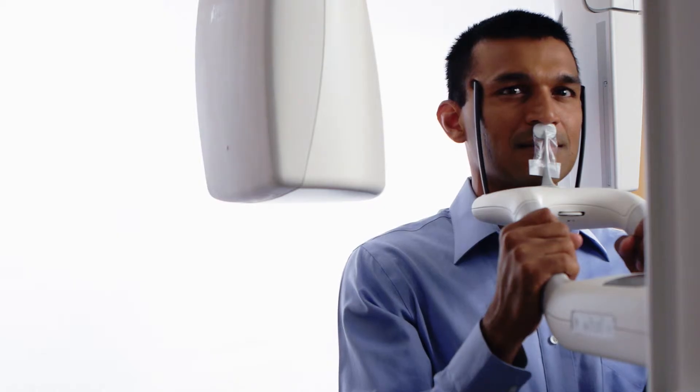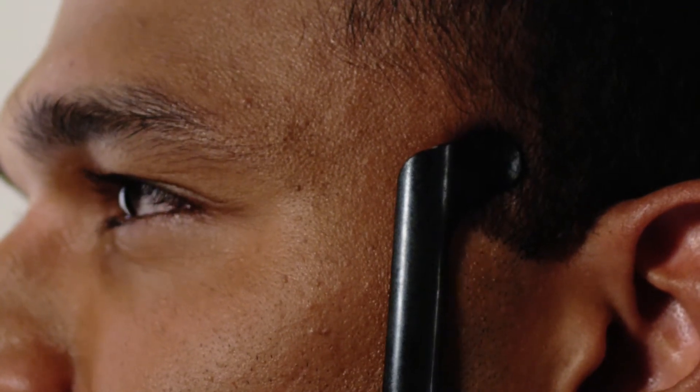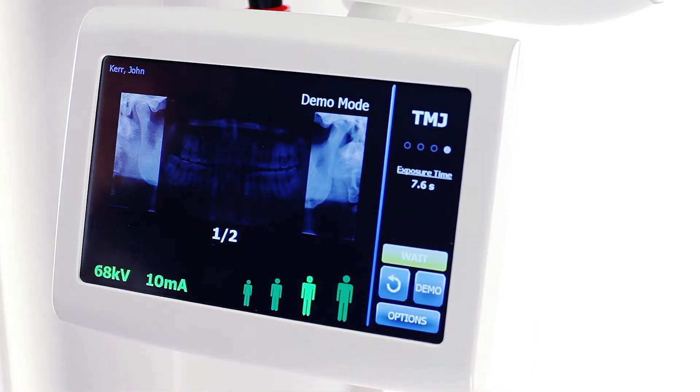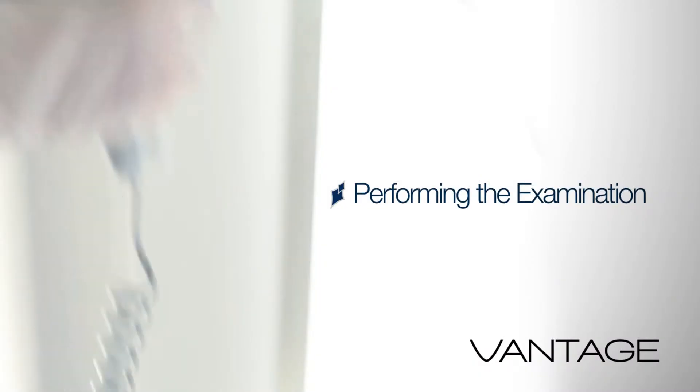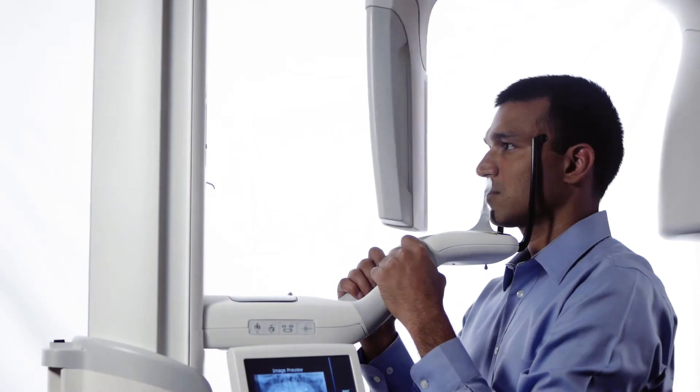Inform the patient to remain still. On the Vantage Touch, enter the ready for imaging position by tapping the cycle button once and verify the green ready condition. Ask the patient to close the mouth, remain still, and hold their breath. Perform the first scan of the TMJ examination.